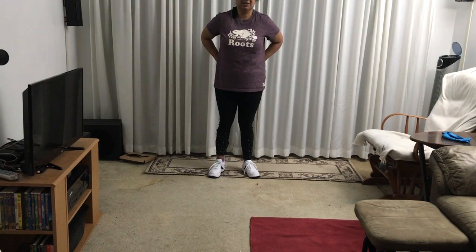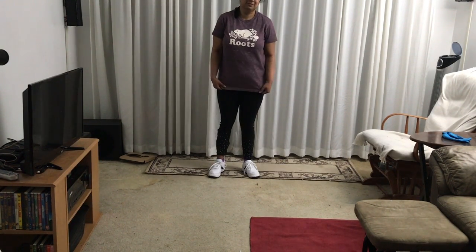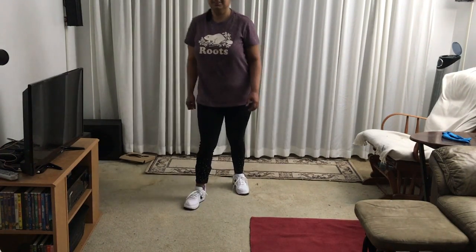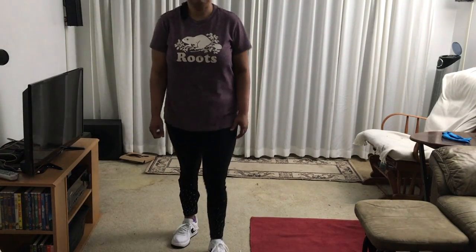Apparently the more I walk, the more my body will realize that it can correct itself. So demo one — walk toward the camera — and I have to learn to take small steps for now.